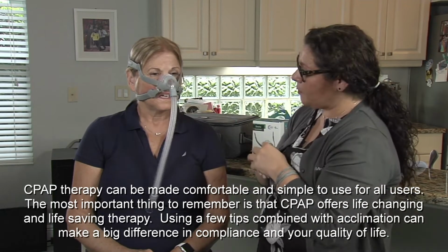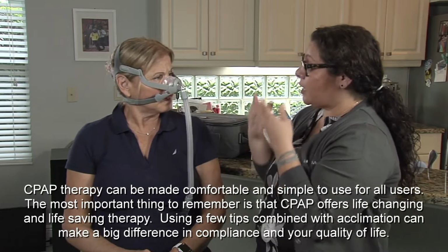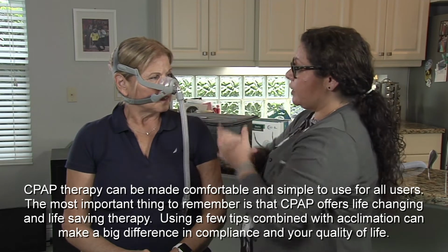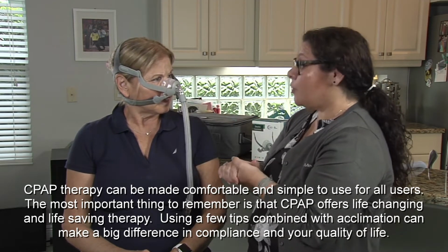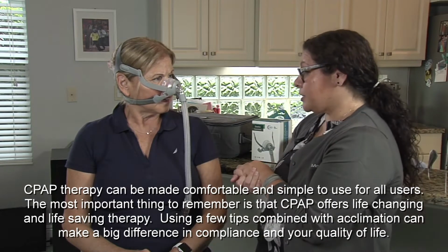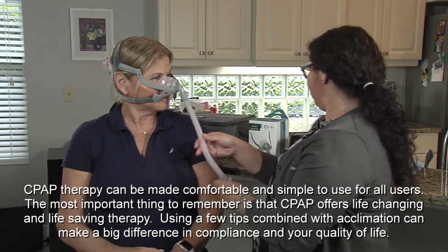How's that, Patty? That feels comfortable. Is it pinching your face anywhere? Not at all. Are your nostrils completely inside the cushion? Yes, they are. Perfect. We're gonna go ahead and attach it to your CPAP so you can feel what the air feels like. Okay, I'm ready.